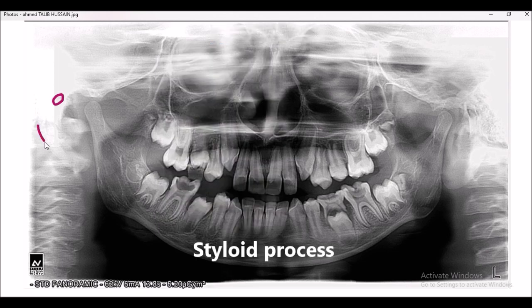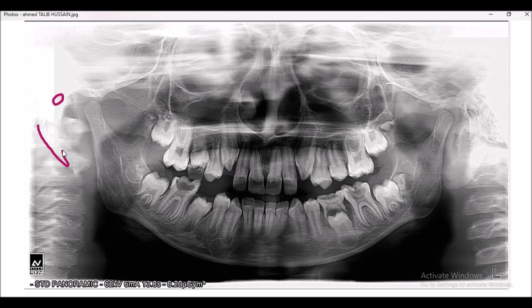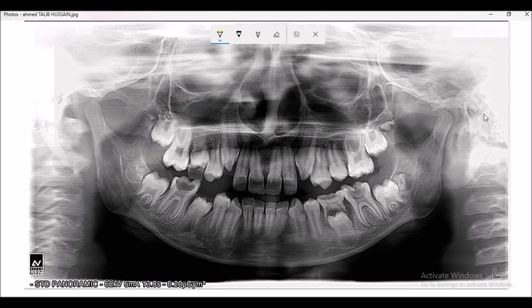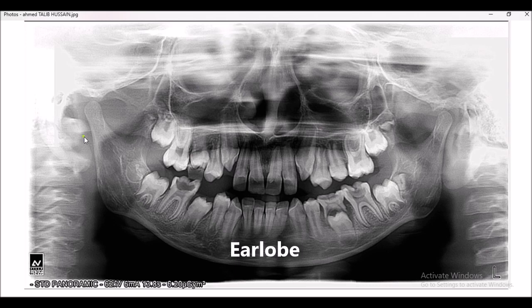This structure is known as the styloid process. You can see these two shadows — these are the ear lobes. This is the ear lobe of the right side, as you can follow my pointer.